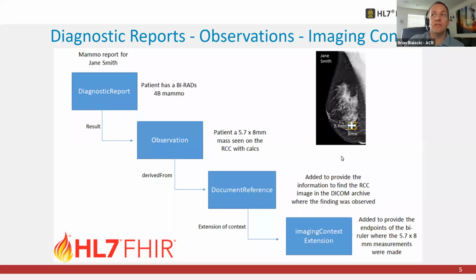If I pull up this image today using FHIR, I could look at the markup, if it is saved, where I'm getting the image from and correlate it to it. And there's one markup on this particular image that seems very straightforward. I'd be able to find that. But if there was no markup, I might be looking in this particular area. Or if there were two arrows on the image, one to this area and one to this area, I'd want to be sure which one I'm specifically talking about.